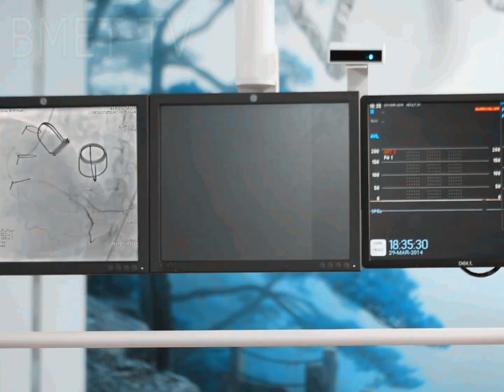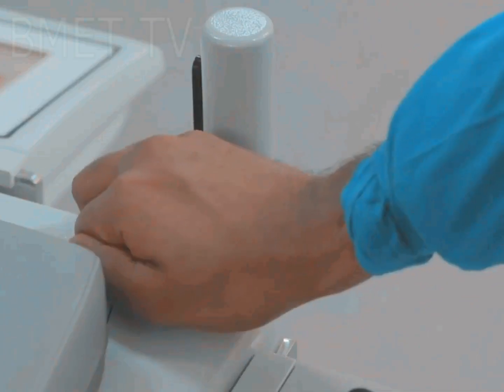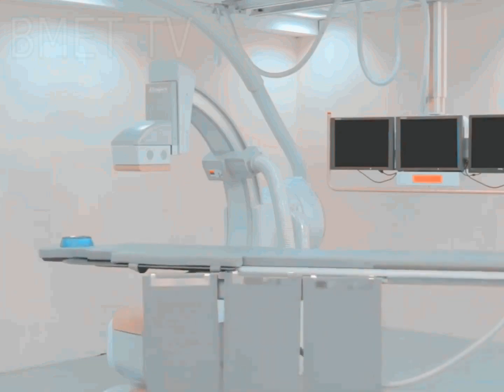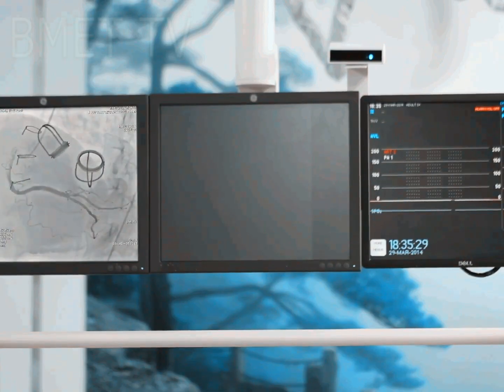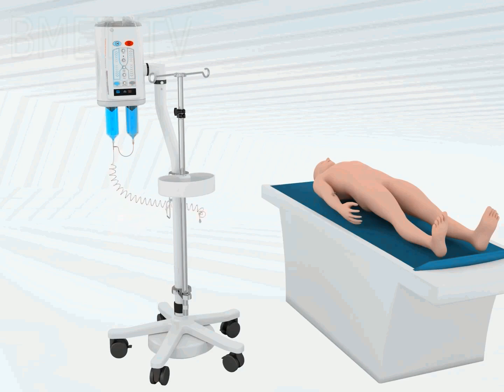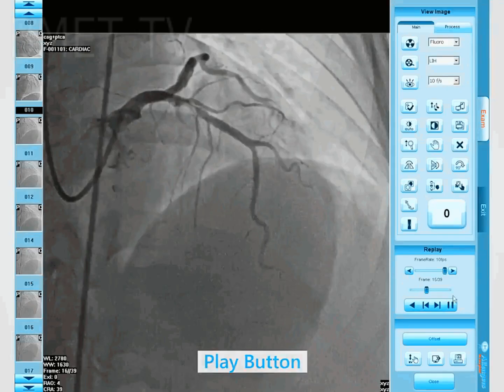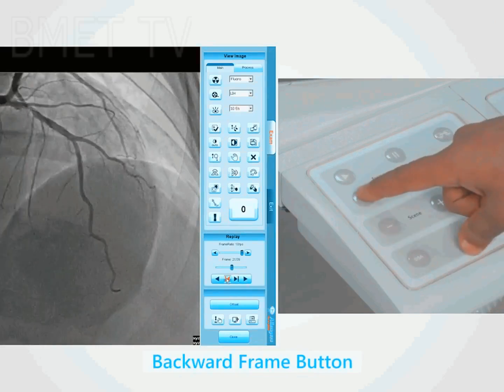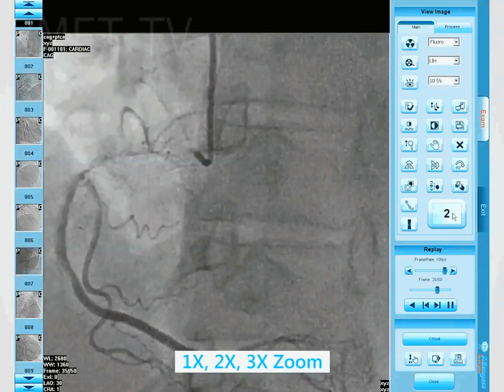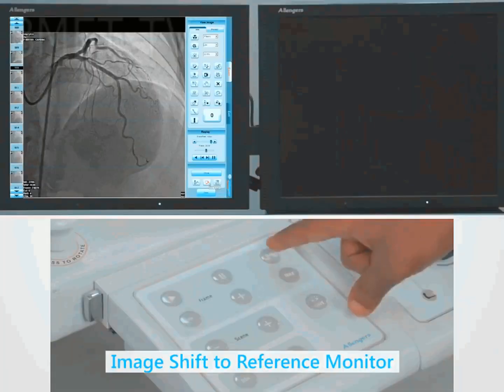Other significant cath lab parts include patient table, operating console, cath lab monitors, patient skin dose logging system, physiological monitoring system, automatic injector, and in larger installations, biplane X-ray systems. Also, the ability to connect the cath lab system to medical data lines into the hospital mass data storage, PACS, and information system should be carefully examined.